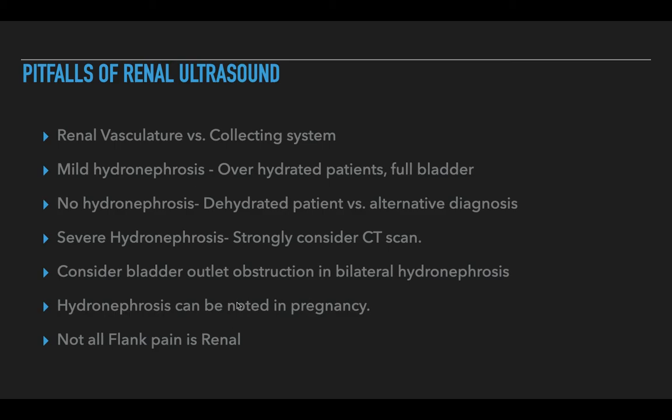Hydronephrosis can definitely be normal in pregnancy, just given that the gravid uterus can compress where the ureter is located. And remember, not all flank pain or renal colic is renal. In that patient who is the right age, maybe older, and having really bad back pain, you definitely want to take a look at their aorta.